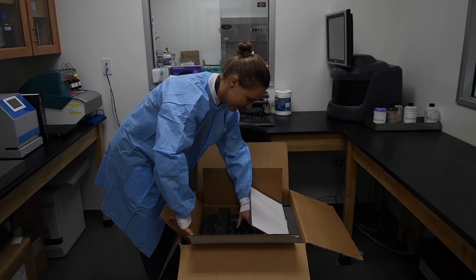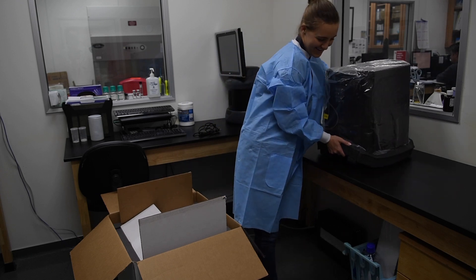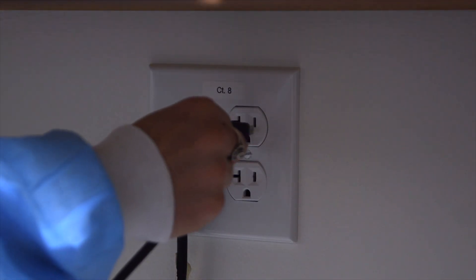Open the shipping box and remove the electrical cord. With one or two people, lift the machine onto a flat surface. The power cord connects at the back of the instrument. Plug in the instrument.